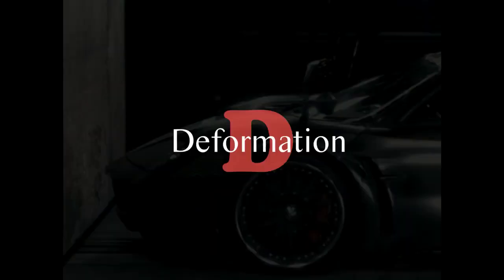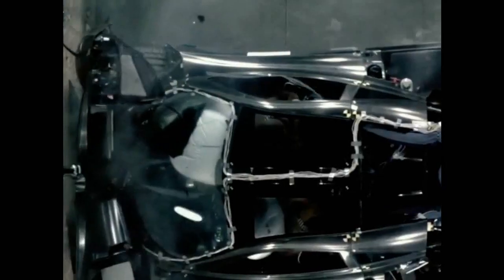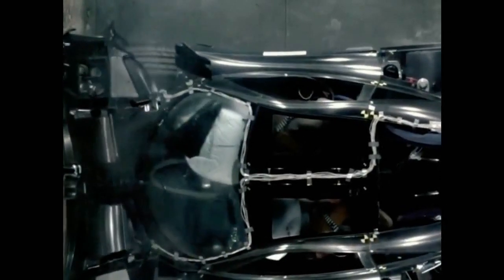So to overcome these pitfalls, we began to look beyond just tissue velocity, and we started to look at more local parameters, such as myocardial deformation. But what is deformation? And how do we measure it? Before we can answer these questions, it is important that you understand that the concept of deformation is at the very foundation of understanding strain echocardiography. And thankfully, deformation is relatively easy to understand because we see it in everyday life. Deformation is simply the change in size of an object due to an applied force.